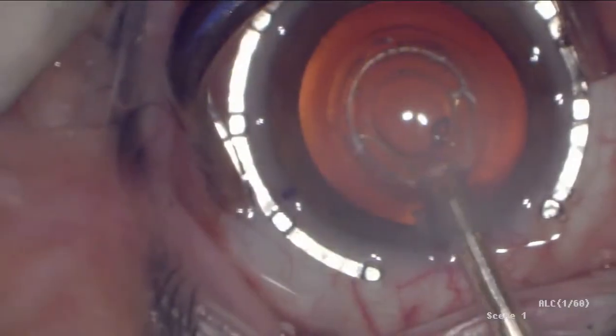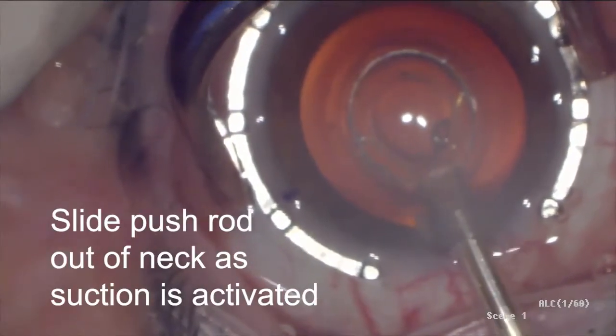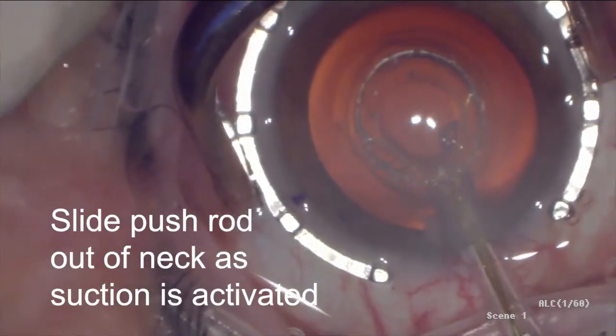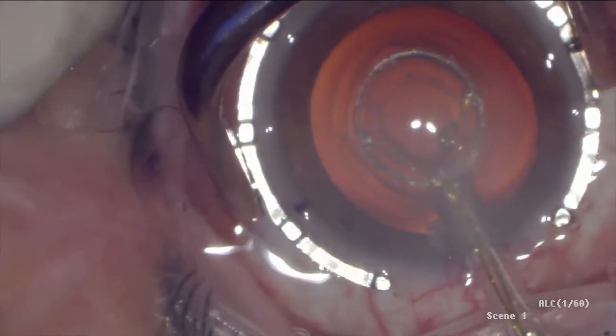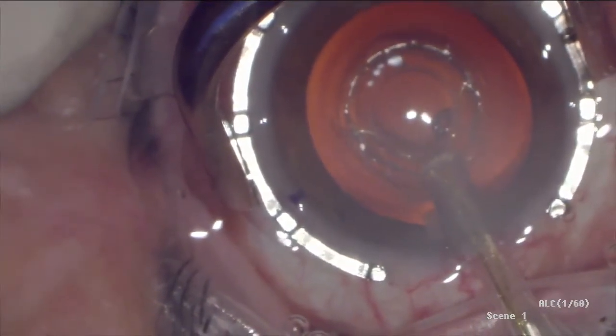Once centered on P1, suction was activated on the surgeon's command, and the push rod was gradually pulled back all the way out of the neck, allowing full suction to be delivered via the neck into the PPC suction cup for a complete capsulotomy.